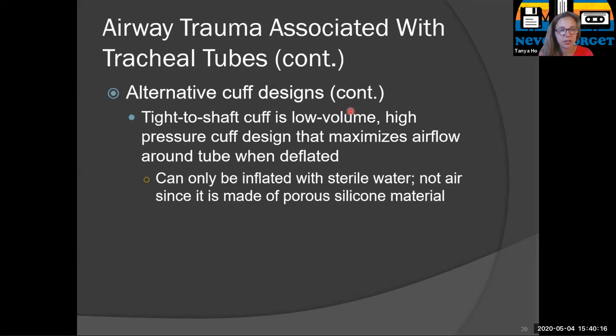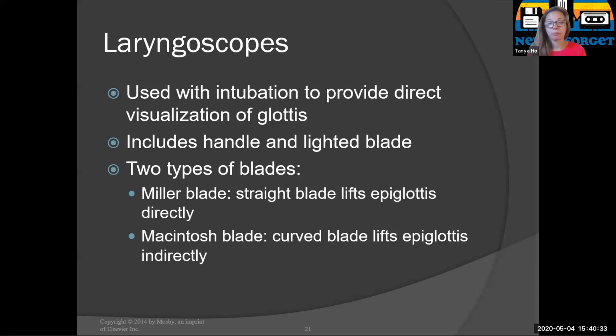Okay, so see it says here, low volume, high pressure cuffs. Some of them you can inflate with water, but other ones not air. But most of the cuffs that I've seen are just high volume, low pressure cuffs. Okay, so that's the endotracheal tube.